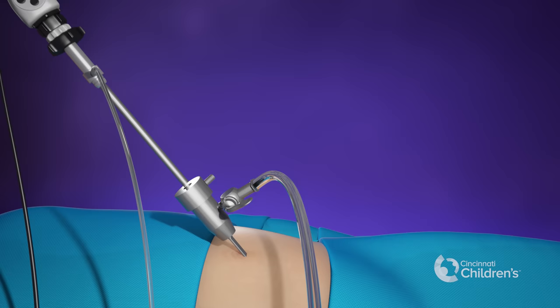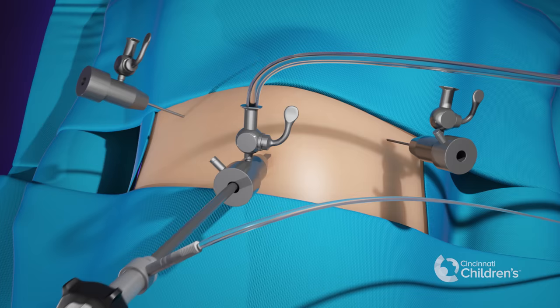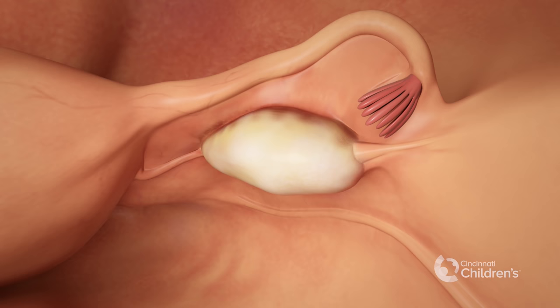The surgeon looks at structures in the abdomen and around the ovary to make sure the surgery can be safely completed. Generally for small children, the entire ovary is removed, but for older girls and women it is possible to remove only the outer layer or cortex for preservation.